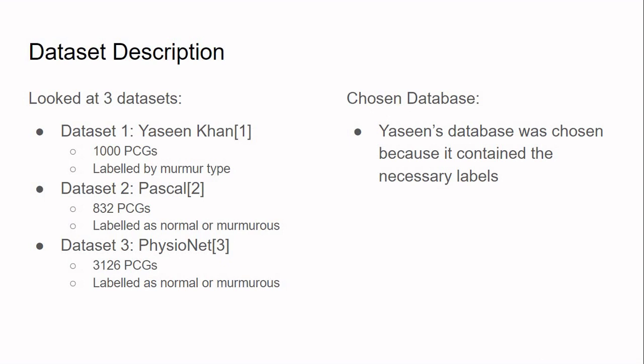Therefore, for this project, we chose Yassine Khan's database, since our project needed to be able to identify the type of murmur present in a phonocardiogram, not simply whether or not a murmur is present in a phonocardiogram.